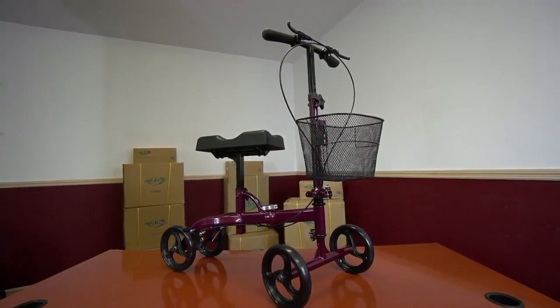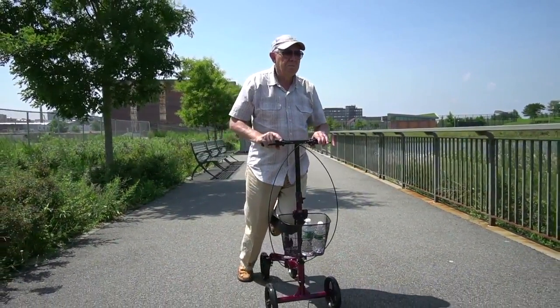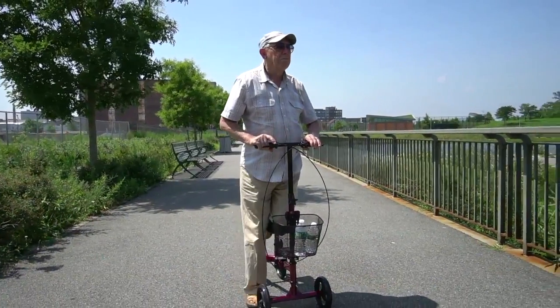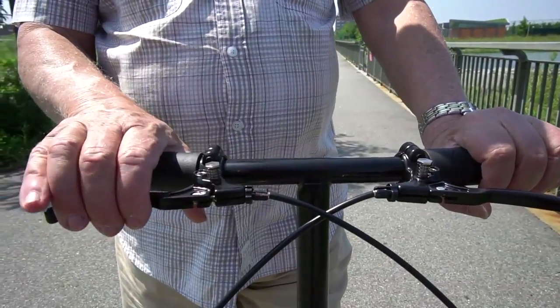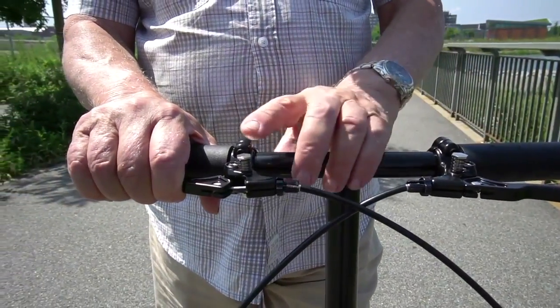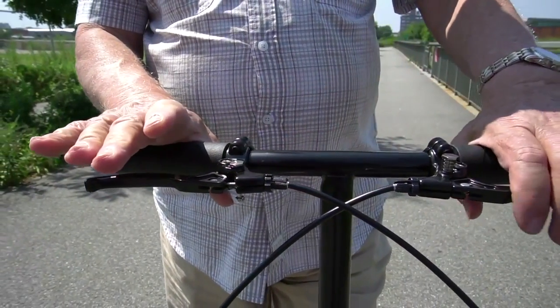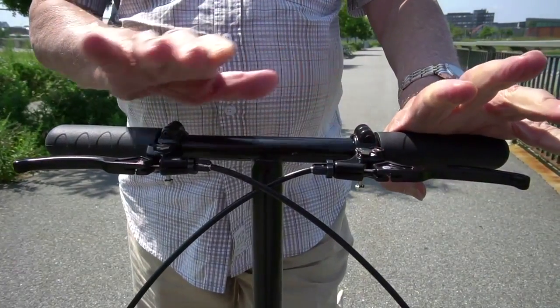Your scooter is now fully assembled and ready to go. Now you can enjoy long satisfying walks indoors and out. The wire basket is perfect for storing small items such as books, glasses, snacks or a phone. The brakes can be locked to prevent the scooter from rolling inadvertently. To lock the brakes, squeeze the handbrake and push the spring-loaded locking pin down. Do it on both sides for extra security.